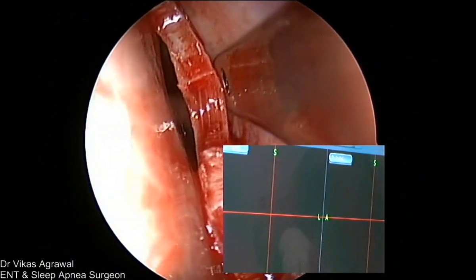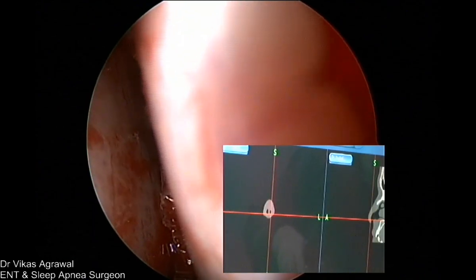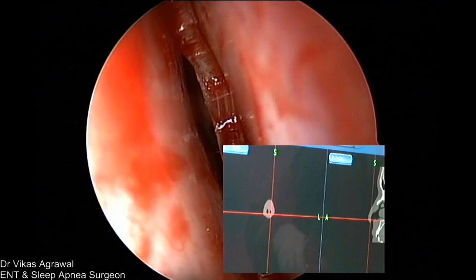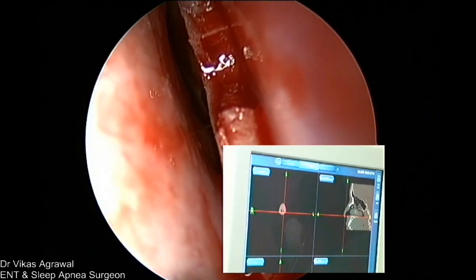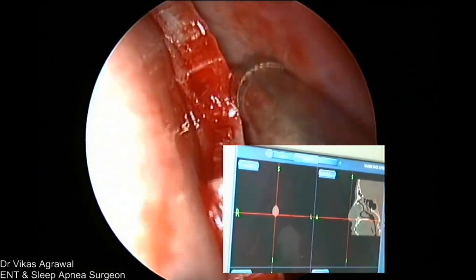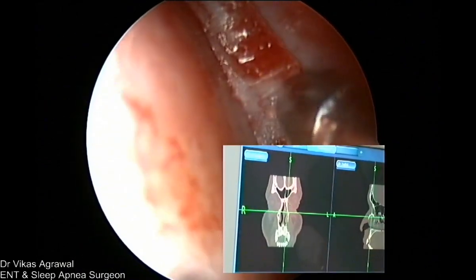Okay, now I'll show you on PIP. Suction, one more please, put this one. Suction please. Where is this part? I'll just show you. Yeah, on the... no, it's not perfect. Only the coronal one. Only the coronal. Yeah.